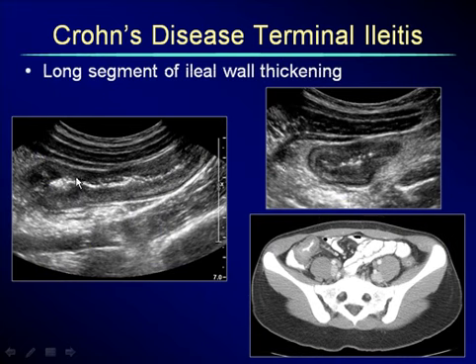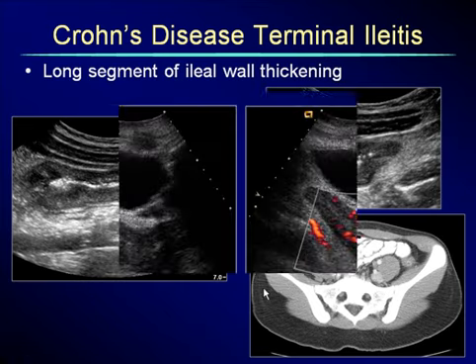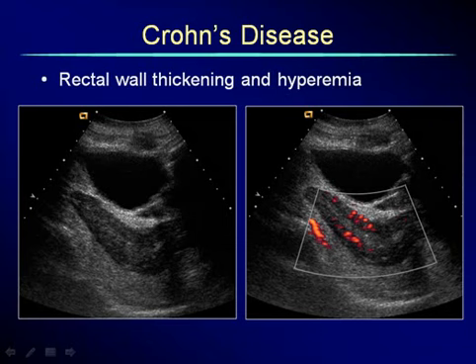This patient with chronic right lower quadrant pain had this long loop of bowel right under her abdominal wall, thick-walled. It went on and on and on. It continued. This was not an appendix. It has bowel signature, but it's not the appendix because it was not blind ending. We turned on it. It looks like bowel. It correlates beautifully with the terminal ileum, which is very abnormal here, causing edematous impression into the cecum. So this is Crohn's disease terminal ileitis.